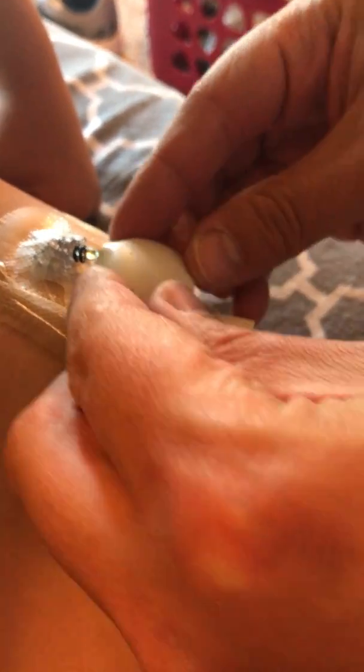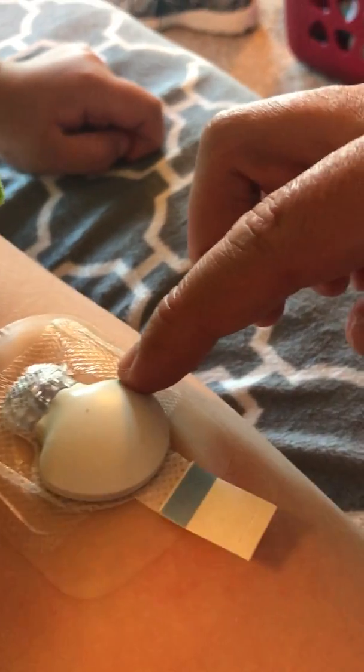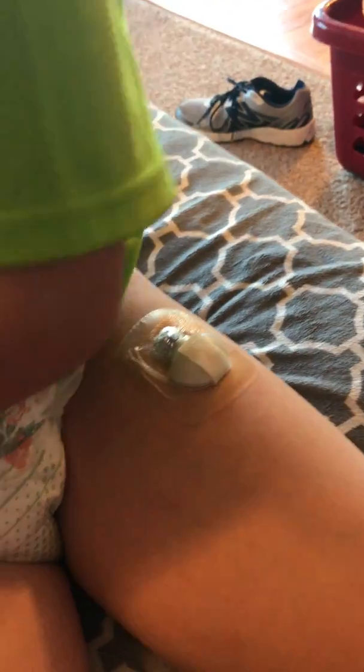Now Jason will just kind of snap it into place. Once the green light starts blinking, you can pull on this. So we're just waiting right now, within 30 seconds or so. There you go. And now Isaac likes to do this where he just gently pulls that back and puts that in place. And then the last thing that we do is we get out this Tegaderm.